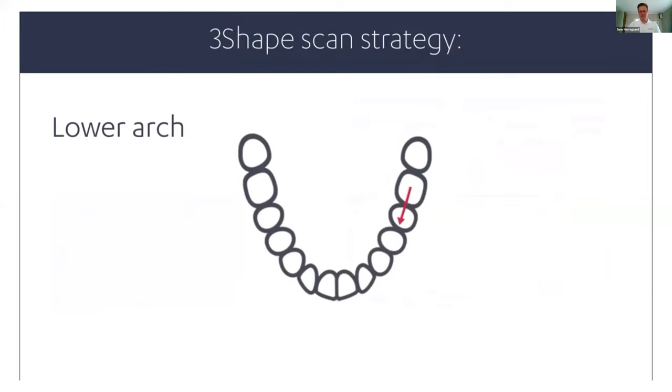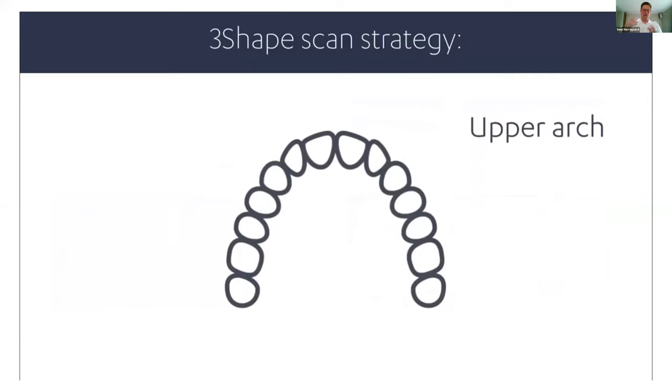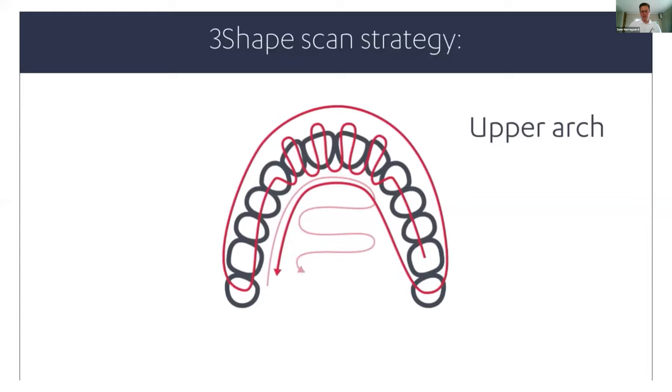So the scan strategy starts on the occlusal surface. That's the surface of the big molar teeth, our bite. Then we move on to the front, where we do what we call the wiggle. That's where we take the scanner and wiggle it a little bit up and down to capture the fine details in the incisal edge. And then we continue the scan.